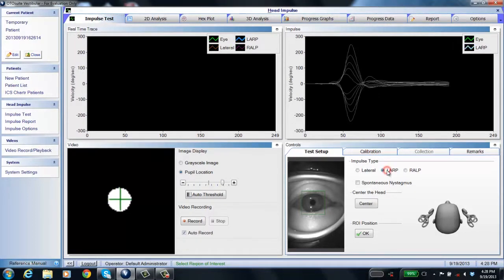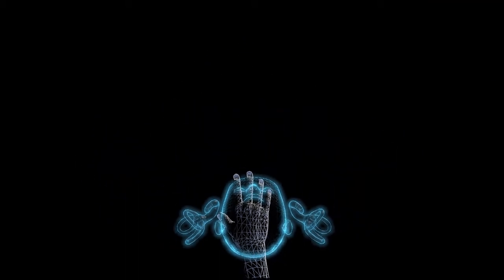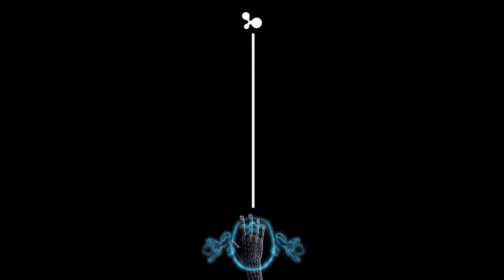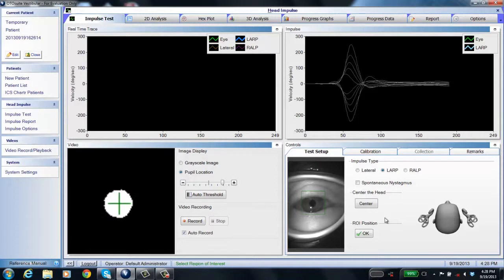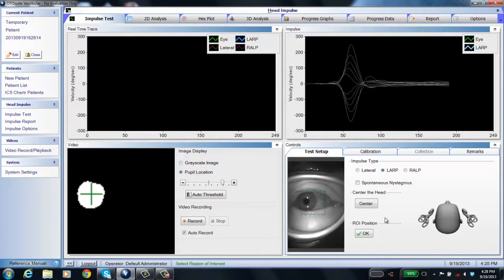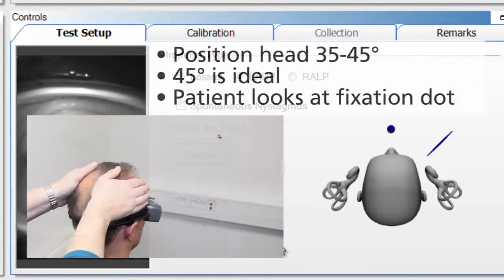Select LARP, and the first thing you need to do is center the head. Make sure the patient is sitting straight directly in front of the fixation dot, and their head is completely aligned with it. The center button determines the zero point or reference point, so the patient's head should be facing straight at the fixation dot and not moving when center is clicked. Click the center button, then move the head 35 to 45 degrees to the right.